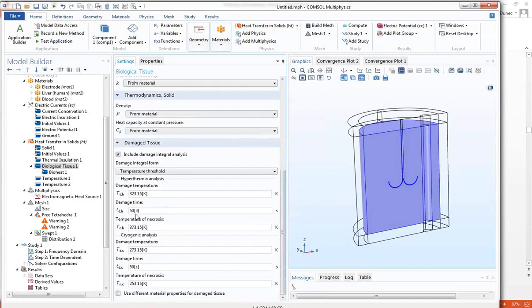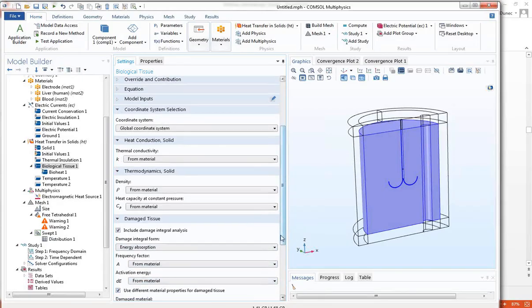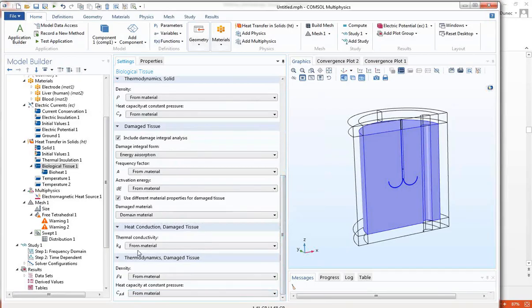But you also have typically like 50 degrees centigrade for 50 seconds or more will kill the tissue. We have that both for high temperature and low temperature, so we can do a cryogenic one. If you freeze it, it's also going to do something bad. Or you can do energy absorption. The other thing that came up in the questions was, what if there are different material properties? Literally, you just pick this and say, if it's damaged, here are my material properties for the damaged tissue. If it's not damaged, use the original ones.